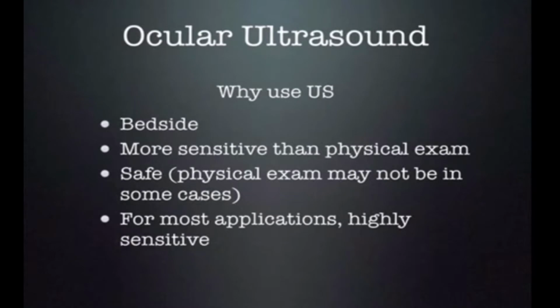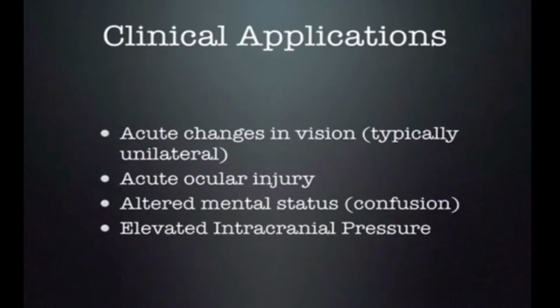So why do you want to use ultrasound? Well, it's bedside, so you can perform it at the patient's bedside or even in out-of-hospital settings. It's more sensitive than physical exam and gives you a lot more information. It is easier to use than an indirect ophthalmoscope. And it is safe, whereas physical exam may not be safe in some cases, such as in globe penetration. And for most applications, it's highly sensitive.